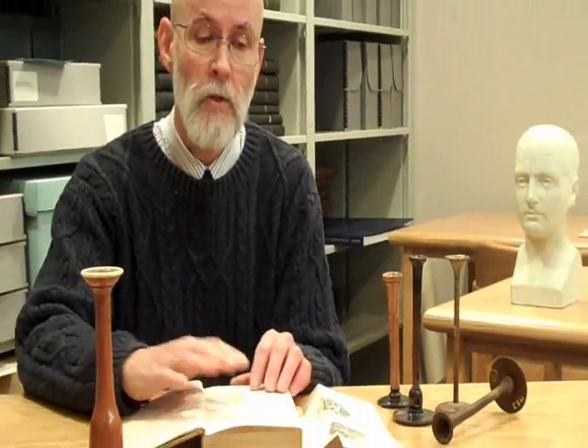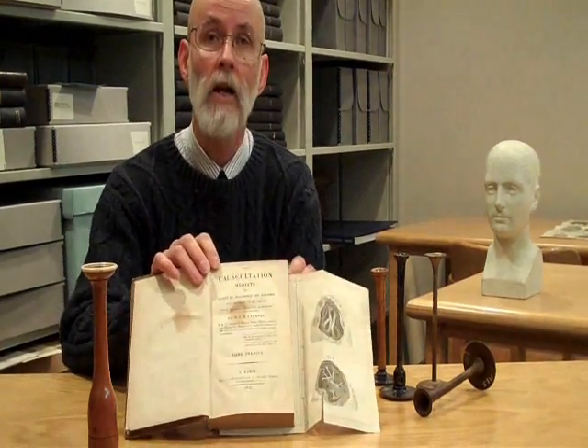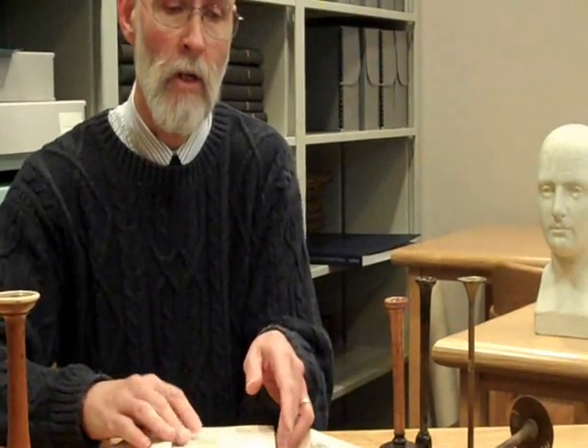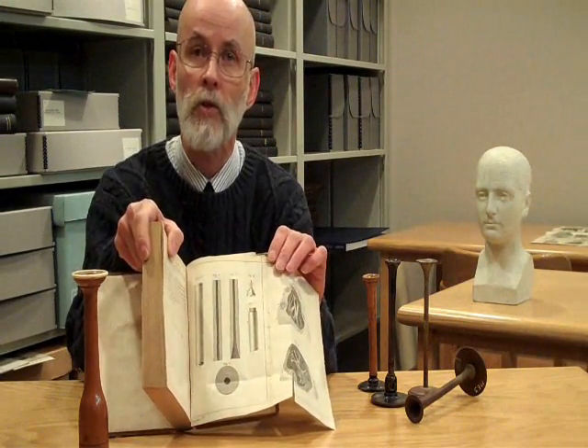Laënnec published his discovery of this instrument and its diagnostic application in 1819. He made his first stethoscope in 1816, then published his findings along with clinical aids for physicians in 1819 in this book from the Miner's Rare Book Collections — on Mediate Auscultation, published at Paris. The book is in two volumes and is also illustrated with plates.